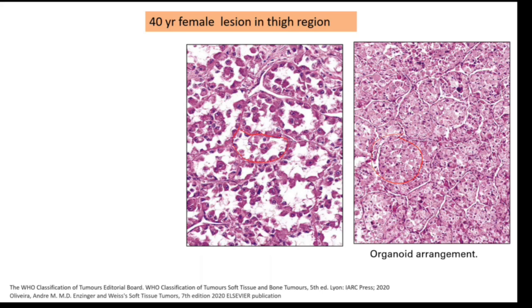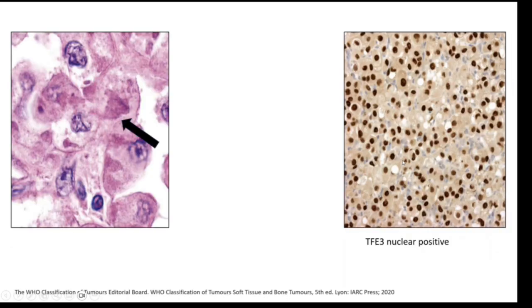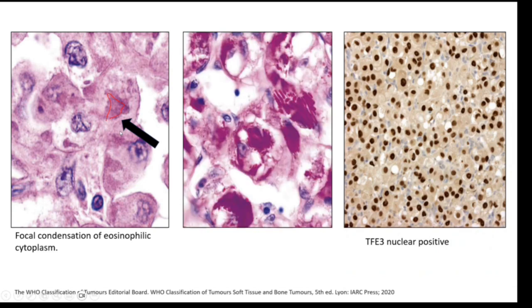This is called the alveolar pattern — also referred to as pseudo-alveolar pattern. The tumor cells are loosely arranged and discohesive in the center. There is also a vessel infiltrated by tumor cells, indicating vascular invasion. The tumor cells came positive for TFE3, and there is lots of eosinophilic material in the cytoplasm.